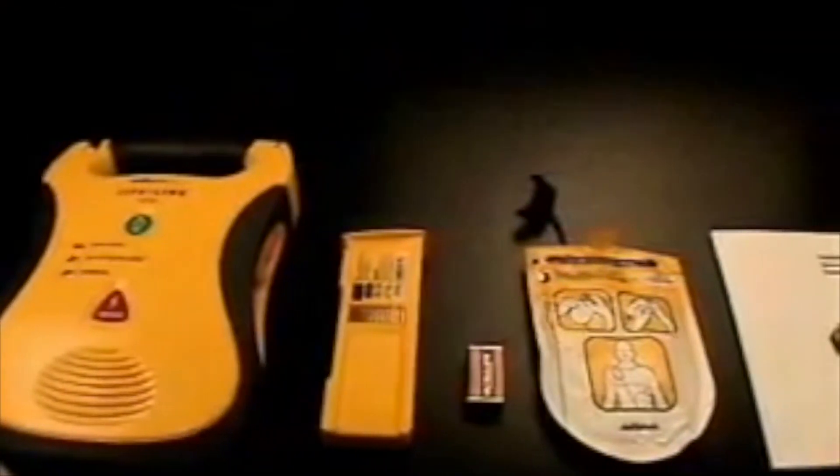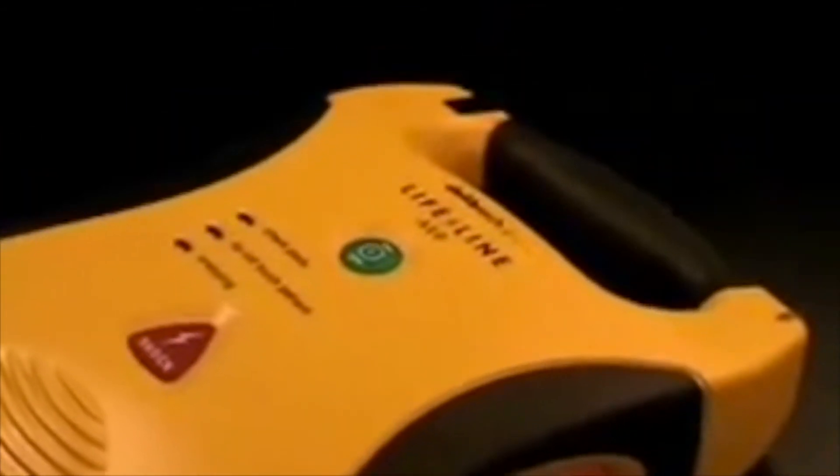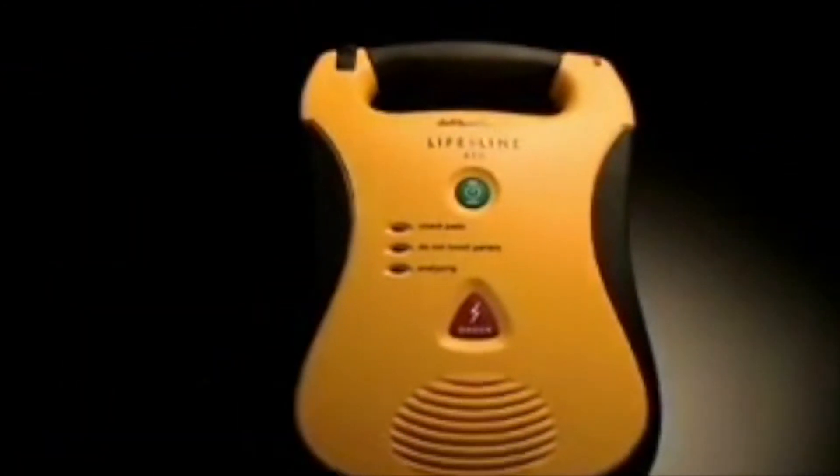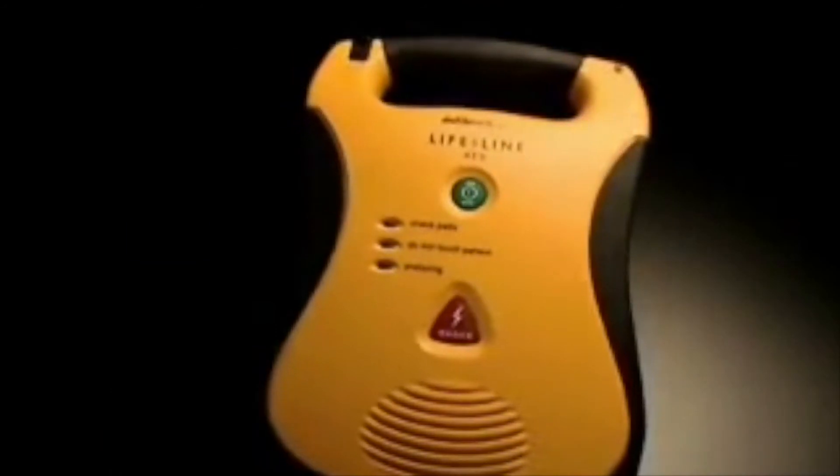With the Lifeline AED, top-of-the-line features don't mean a top-of-the-line price. Our ground-breaking real-world design gives you the performance you need at a price you can afford. With sophisticated medical technology this simple to use and affordable to own.